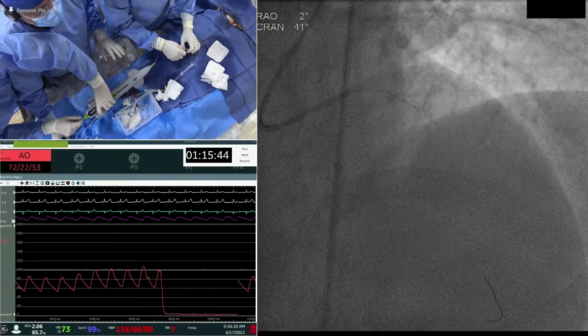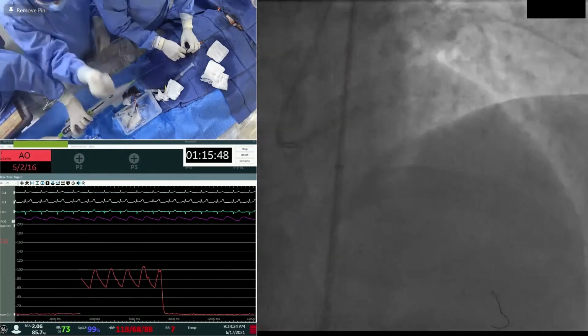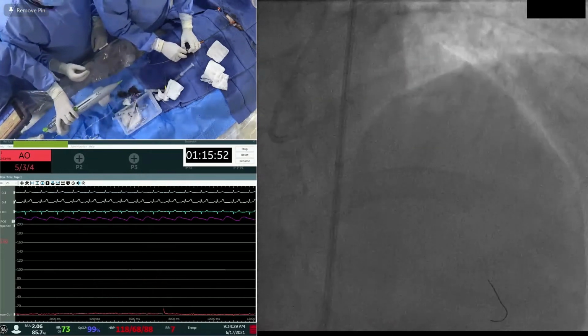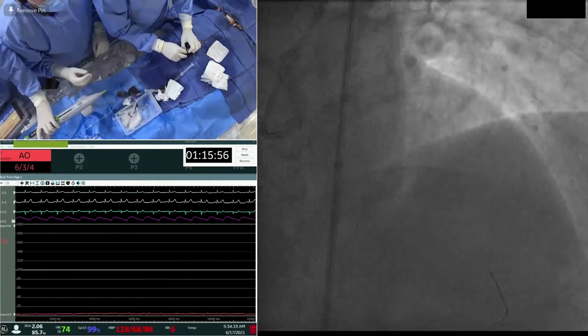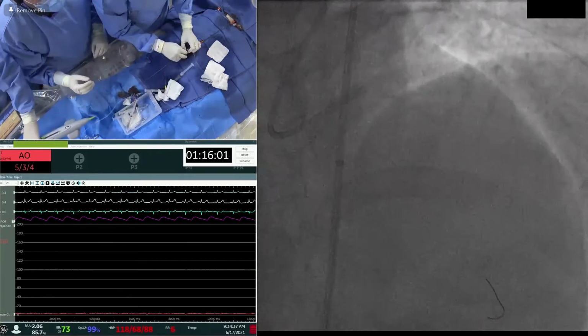30 seconds in between, and we're removing the orbital. Now let's take a peek. Now, if we were able to image, depending on the amount of calcium, we can show the calcification by the side, based on the imaging, how you decide which atherectomy you want to use.